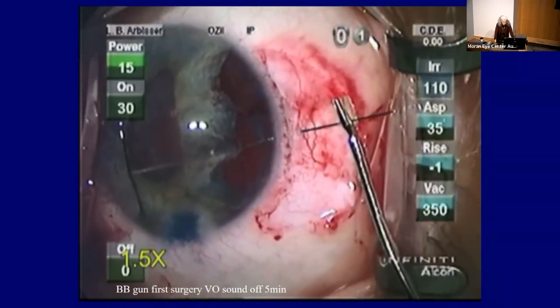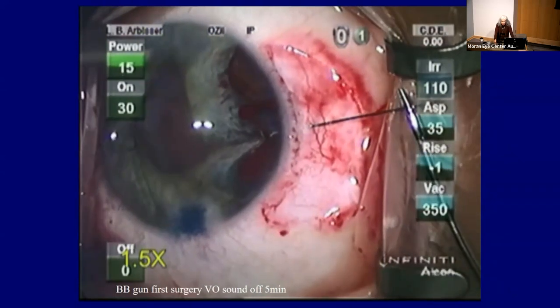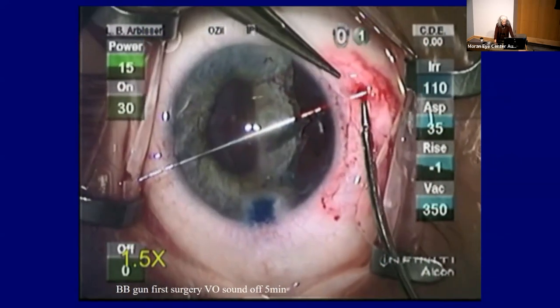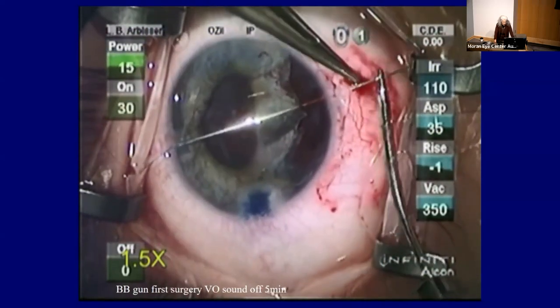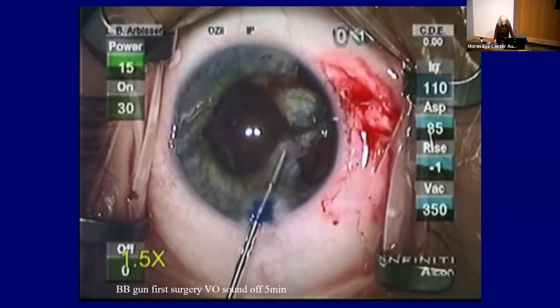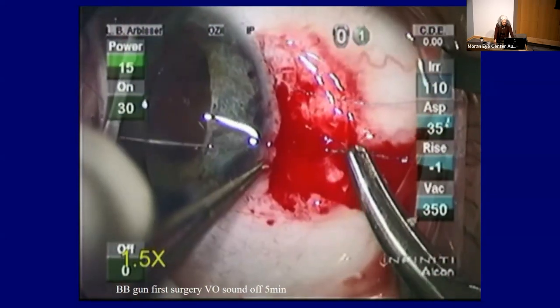And look, I go through the drape. When you do that, you need to get the needle off the tray. So I have somebody else watch. You know, you're too busy to watch everything. So they'll watch if I've invaded my drape and that needle is contaminated, and cut it and get rid of that.